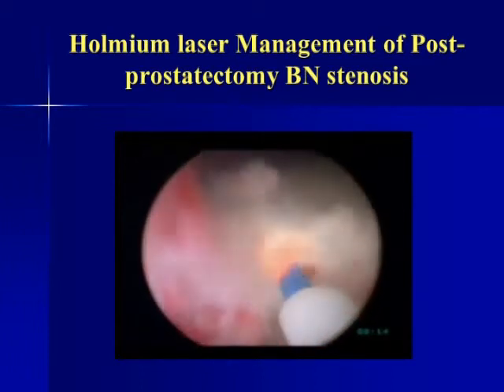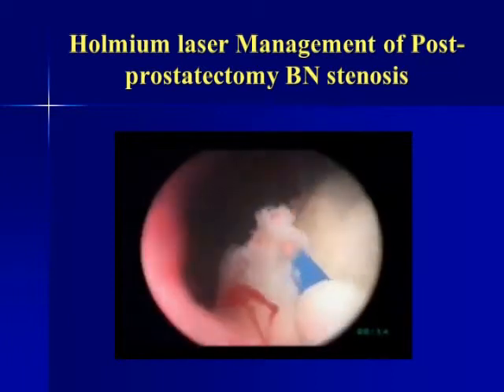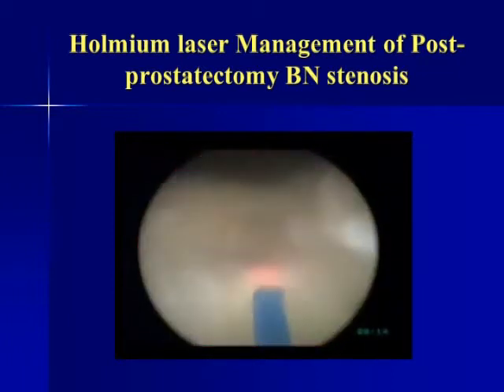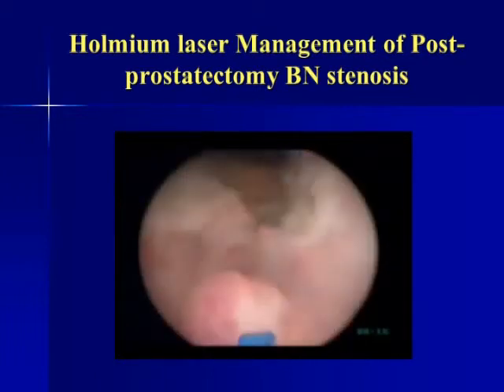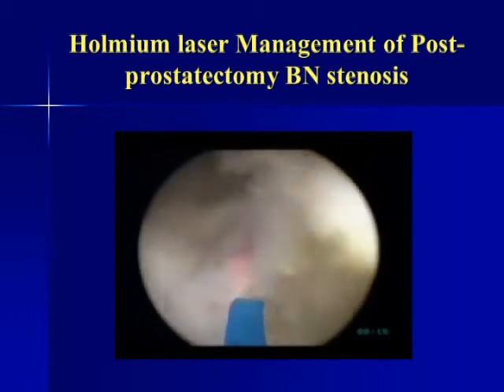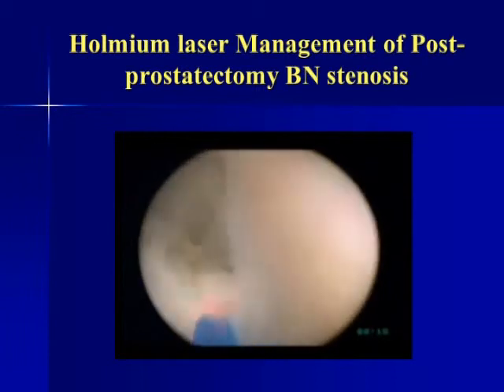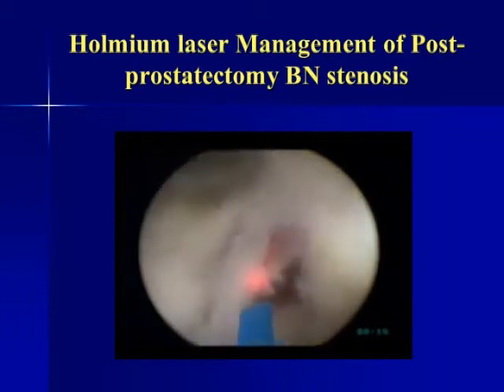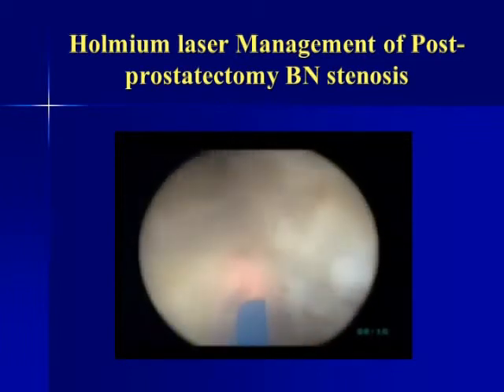Sometimes we can come across residual adenoma tissue which can also be enucleated or resected, so that we can do a good job for the patient at the end of the procedure. It again carries all advantages of lasers, safe in anticoagulated patients, less bleeding. Here I am just removing the extra tissue and making it wide enough. At the end of this, we purposefully cut the capsule till we see the fat, so as to release the complete tension on the tissues. Here I am cutting the capsule deliberately, so that things become wide open, and this will probably minimize the chances of restenosis.